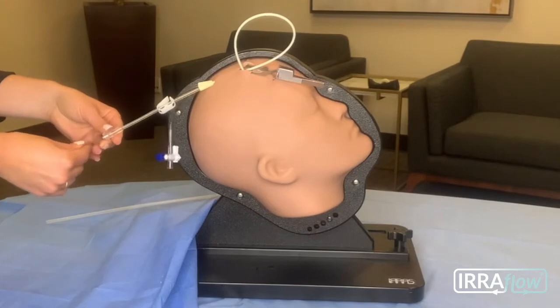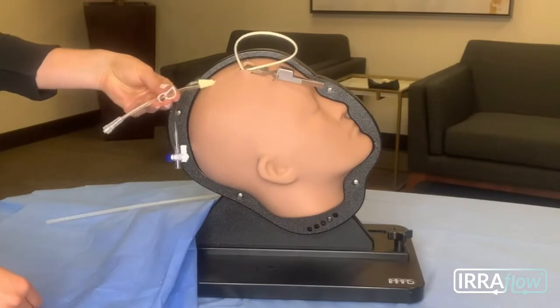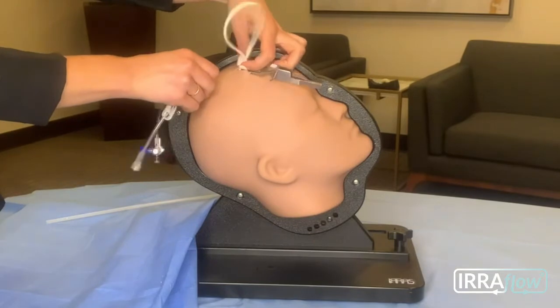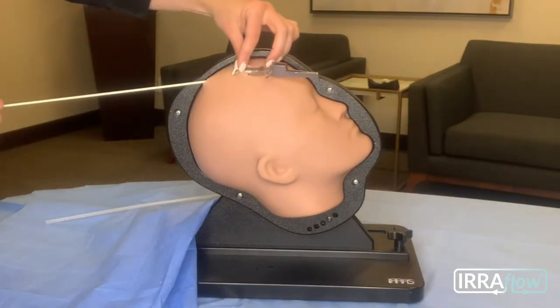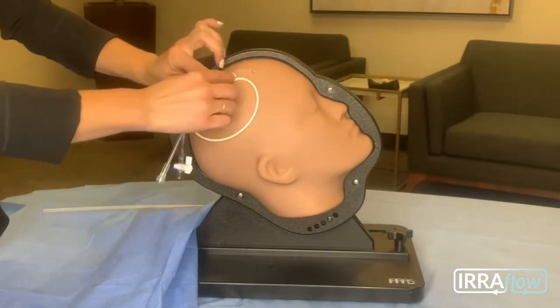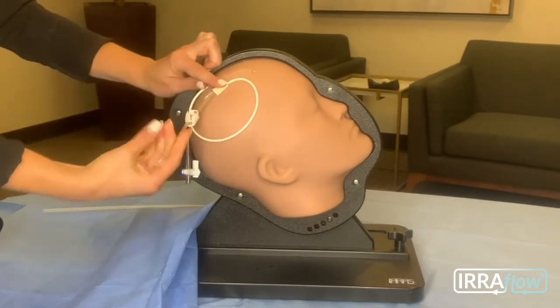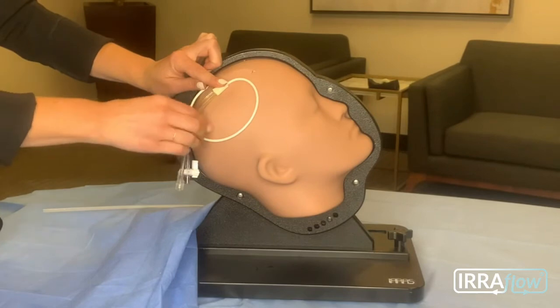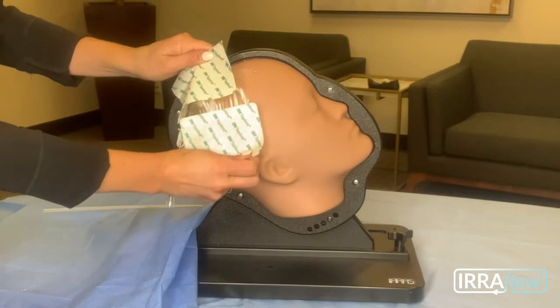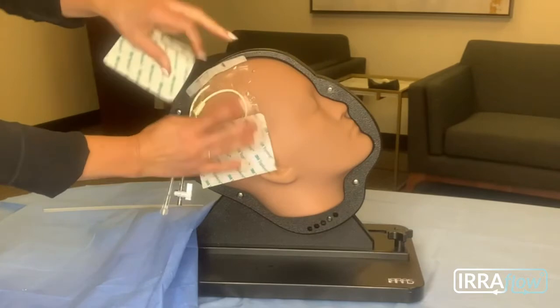Then, suture the catheter in place per your normal procedure, while ensuring adequate skin closure at the cranial access point and the reverse tunnel site. A preferred approach is to create a large catheter loop that is secured with multiple sutures that do not compress the catheter's lumens. During this process, intermittently confirm CSF drainage to ensure that the sutures are not kinking the catheter. A large clear occlusive dressing, such as a tegaderm, should be used to cover and secure the catheter.